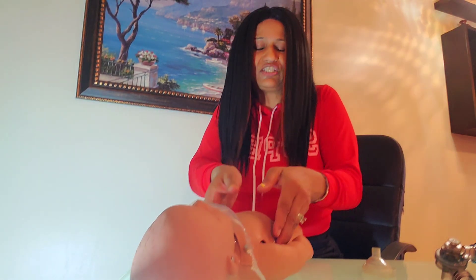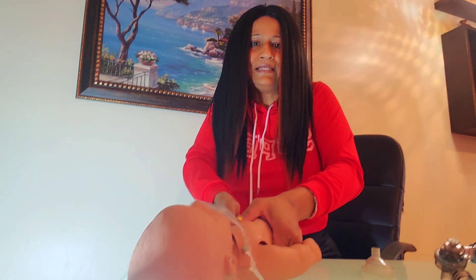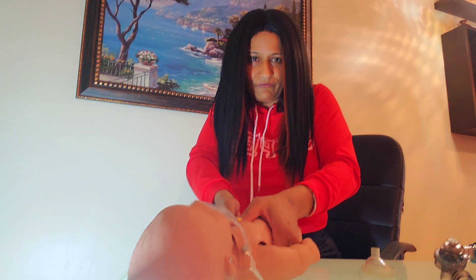I hope this demonstration has provided some educational material on how to perform CPR on an infant for a one-rescuer scenario. If you are two rescuers on the scene, you will use the two-thumb encircling technique, giving 15 compressions — counting 1 through 15.